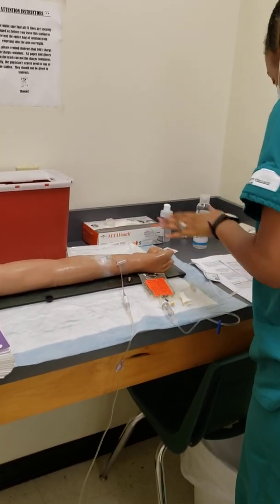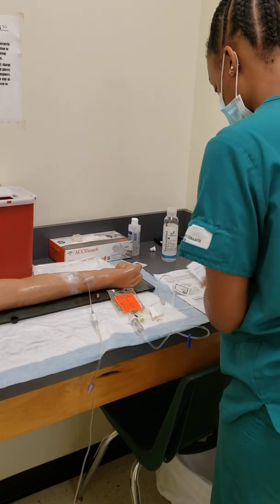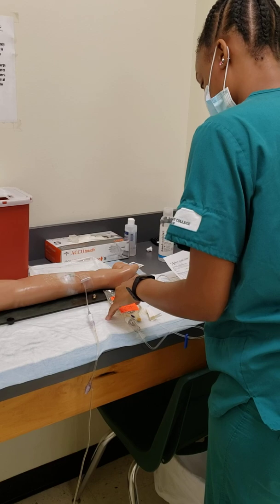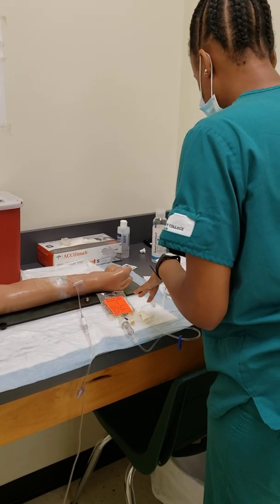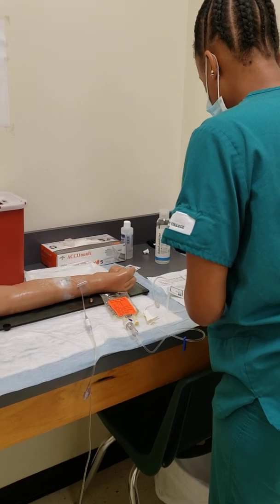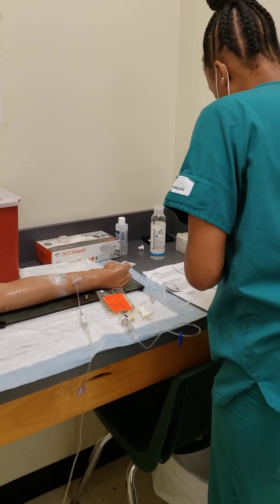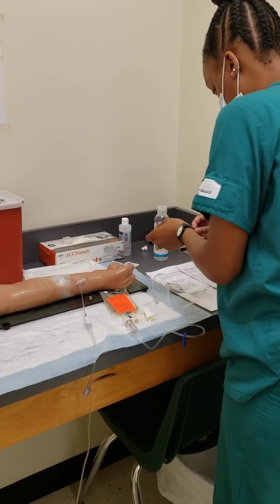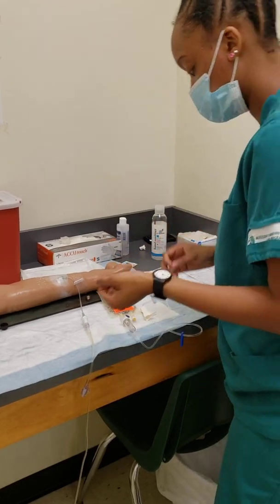Okay, I'm gonna go ahead and perform my third check at the bedside. We have gentamicin. My patient here, Miss Davis, Demetrius Davis, she has no known allergies. Date of birth 4/11/95. She's in room 303. And this is gentamicin. We're gonna be giving 13 drops per minute. And I would divide that by 15 seconds, and it'll be 3 drops.